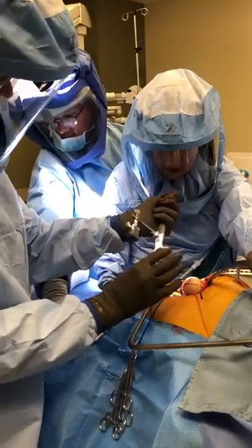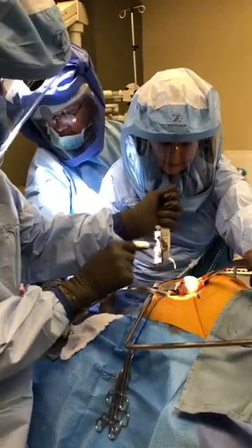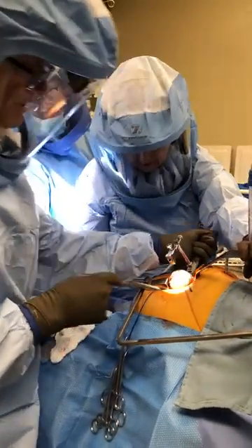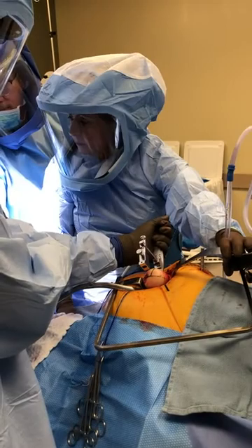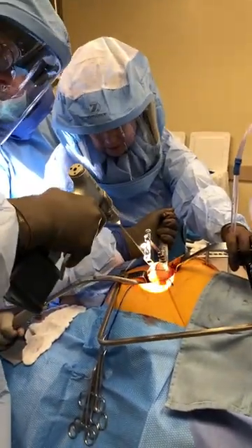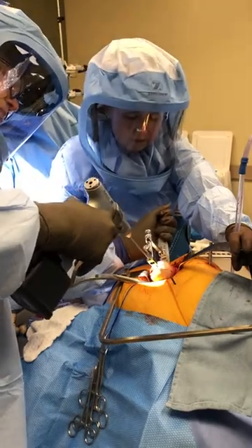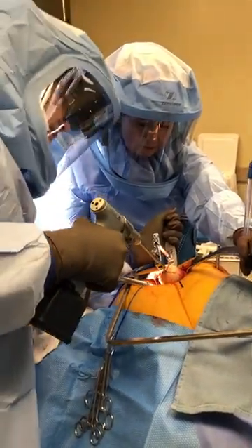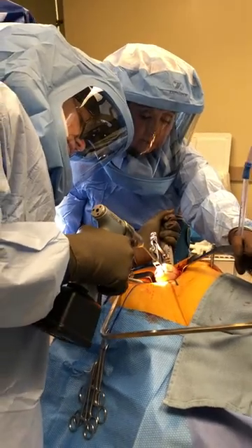So we get this jig on the neck, and it puts this hole. If you put it on zero, it puts the hole right through the center of the sphere. Guidewire, please. So I put this pin on the neck at my marked starting point, and then drive it down about a centimeter to engage it.